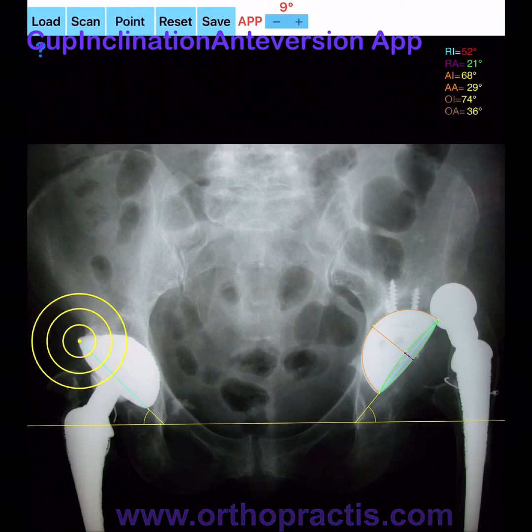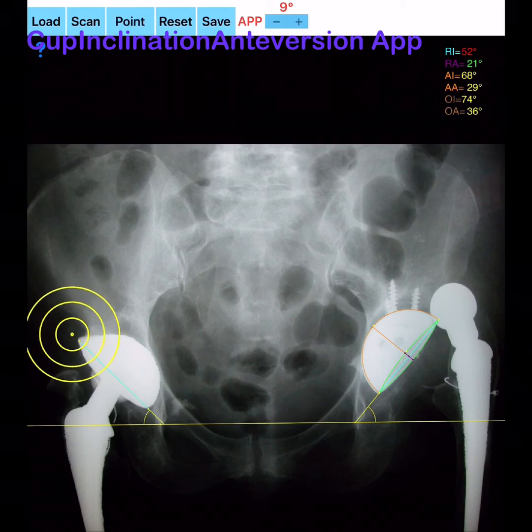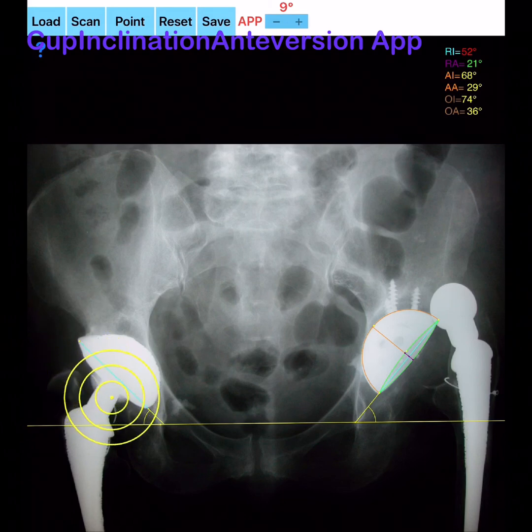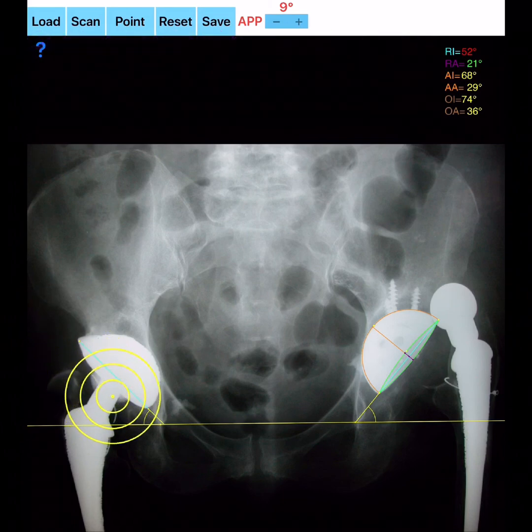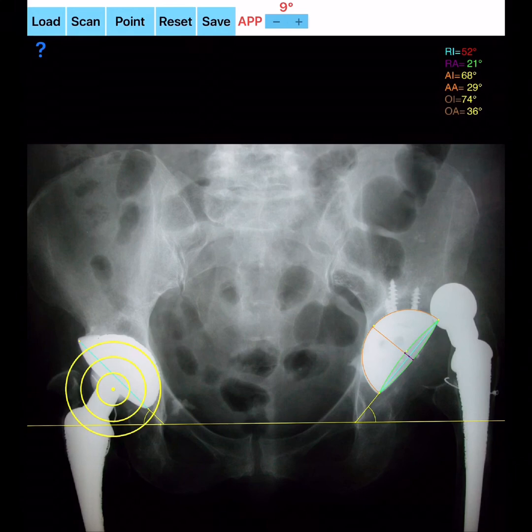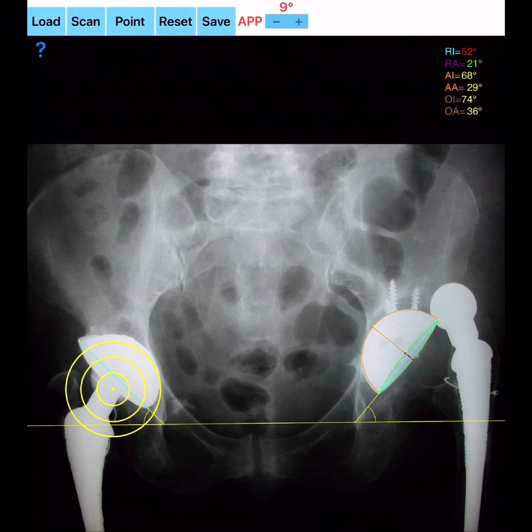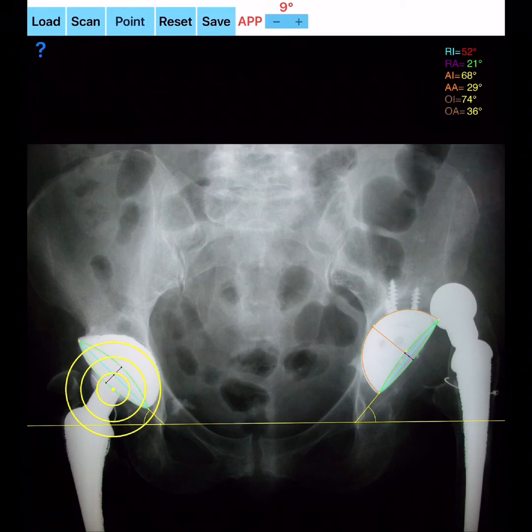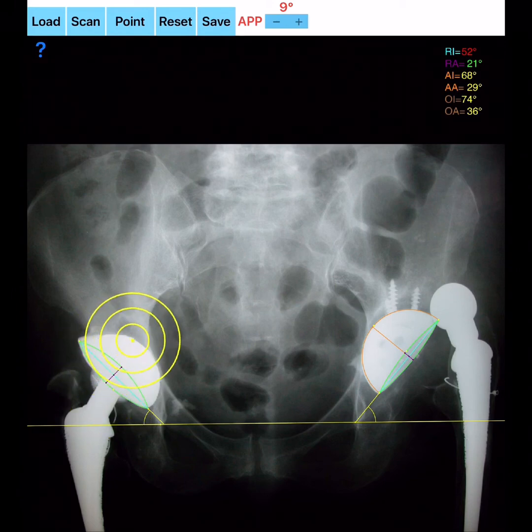For the left side, mark C7 (most medial point of the left cup), C8 (most lateral point of the left cup), C9 (most caudal point of the left cup), and C10 (cephalad point of the left cup). The app then displays: T1–T2 inter-teardrop line, C3–C4 long axis of the ellipse of the acetabular component, C5–C6 total length of the cup, and screen readings of inclination and anteversion angles of the acetabular component.